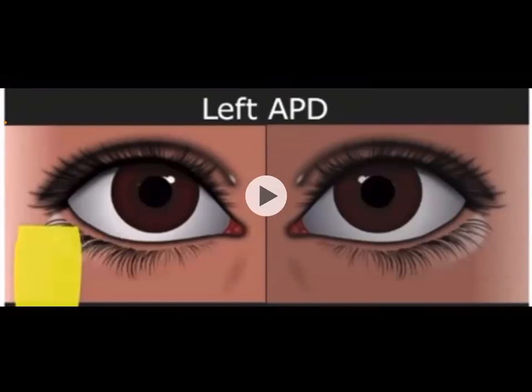Okay, then after the permission and instruction, you need to do some adjustment for the ophthalmoscope, as we mentioned previously, especially if one of the candidates enters the session before you. Maybe you will find the light source open or closed. Maybe you will find the focus is not well adjusted. So you need to make sure first to open the light source, and select appropriate intensity.